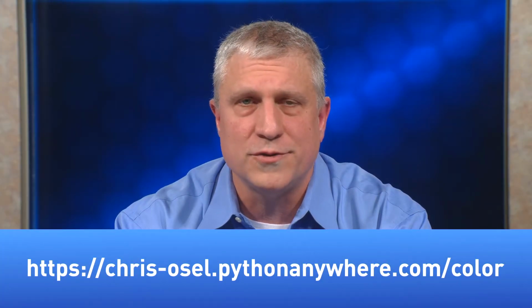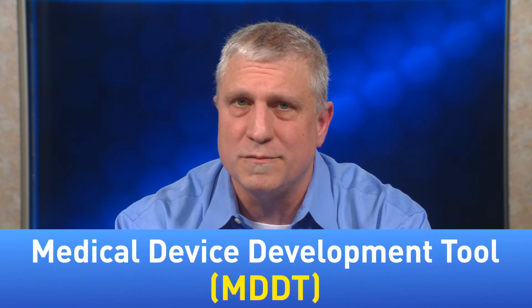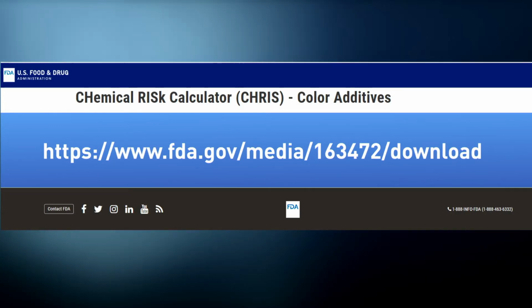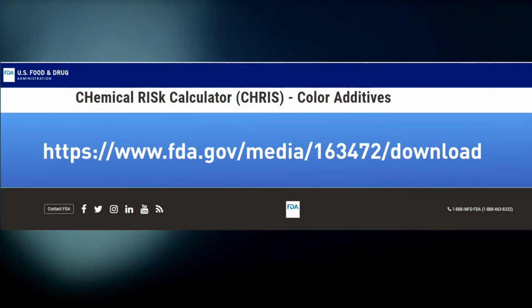The color additive module of CRIS is freely available online at the link on your screen and has been qualified as a medical device development tool, or MDDT. MDDT qualification means that assessments provided by the tool will be accepted by CDRH when they're used to support a medical device submission, as long as the tool is used within the qualified context of use. More information on the qualified context of use for the CRIS color additive tool can be found on the MDDT website shown on your screen.